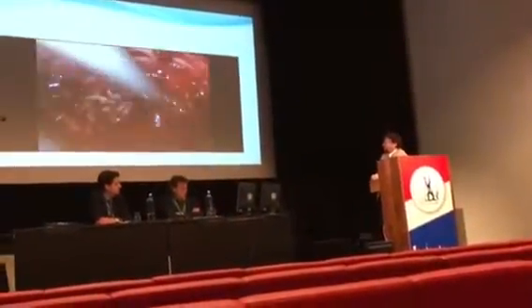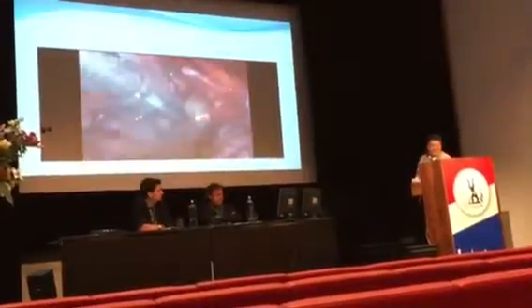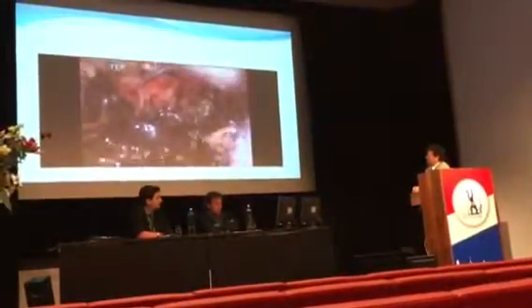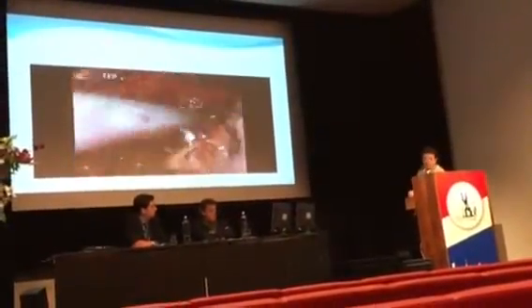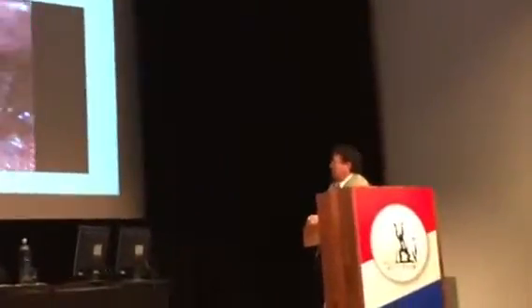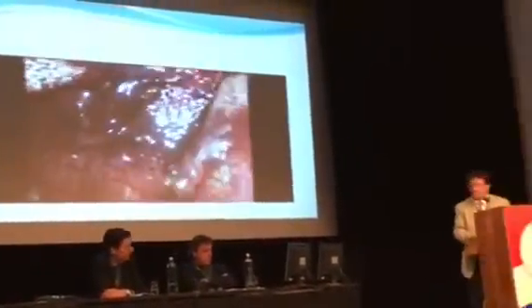That is the TEP converting to laparoscopy, and then back to TEP. You can see here the little bleeding point, which is a corona mortis. And after complete hemostasis has been reached, you can go out. Now no bleeding at this point after extensive lavage. Review of the mesh. So this is the approach to huge and complex inguinal hernia.